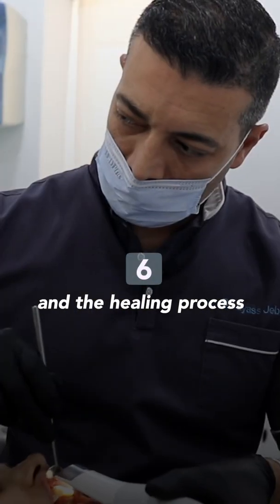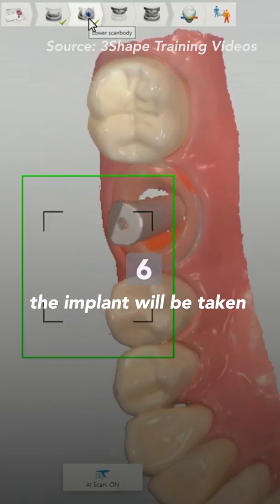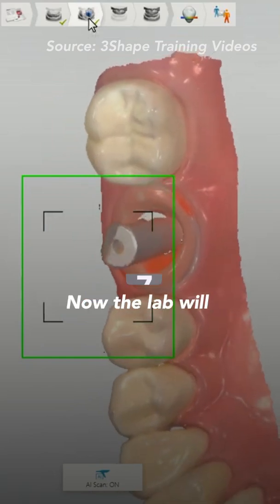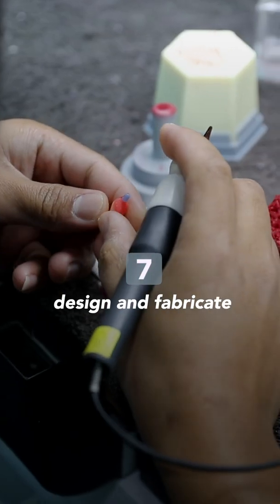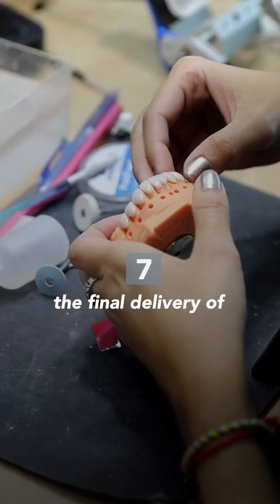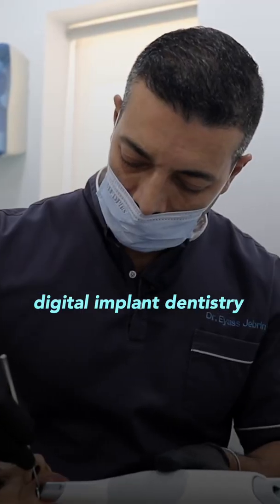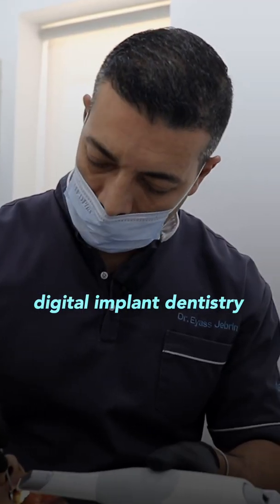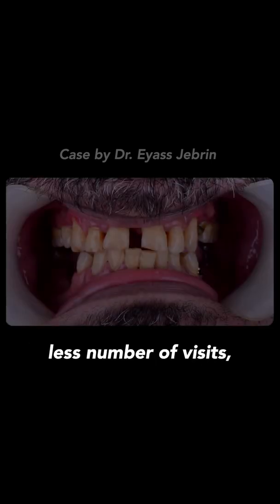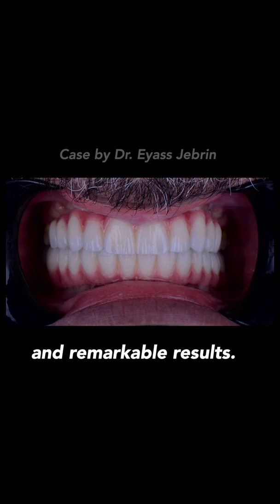After the implants are placed and the healing process is completed, a digital impression of the implant will be taken by the intraoral scanner again. The lab will then design and fabricate the restoration for final delivery to the patient. Using digital implant dentistry can eliminate surgical complications, reduce the number of visits and working time, and achieve greater accuracy and remarkable results.